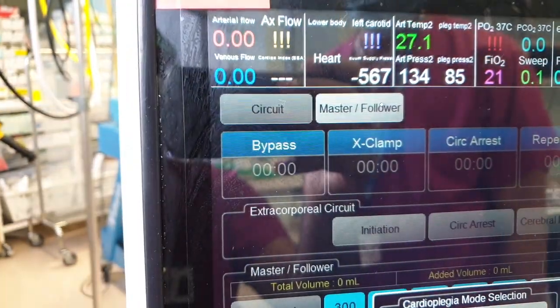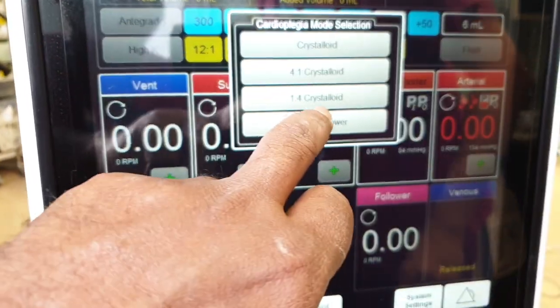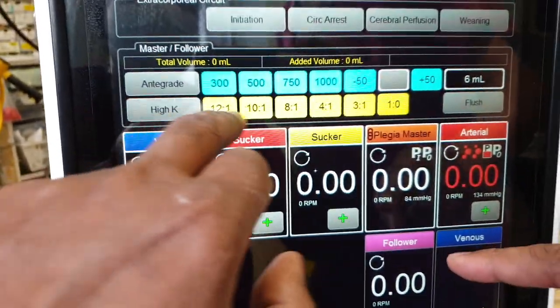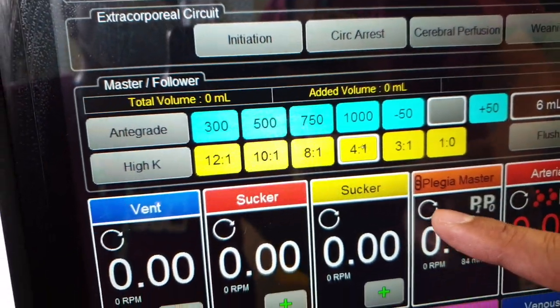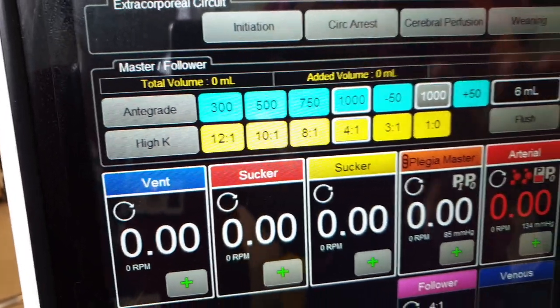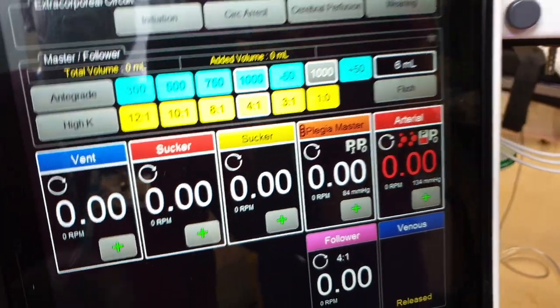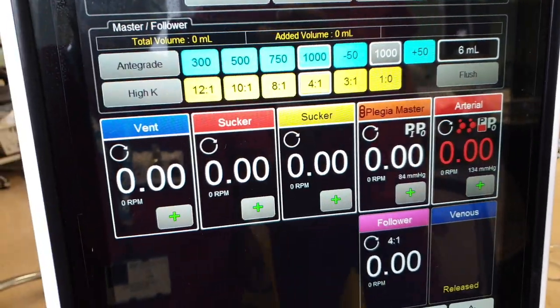Your master follower, that's the ratio. So just go with master and follower. And then this appears. That's our routine setting. And then with him, it's always the priming first. I can set it first. Do you have to literally set this, or can you just give it and stop it? You can do that.